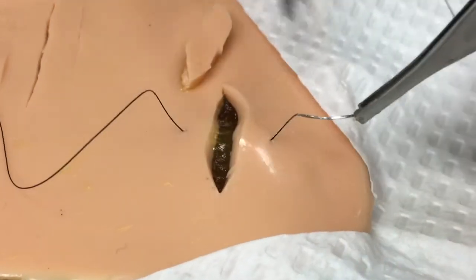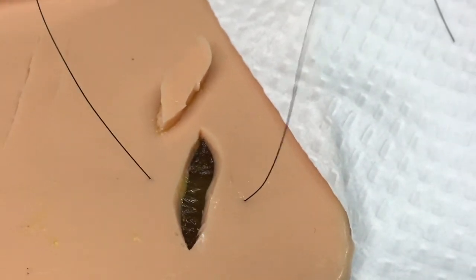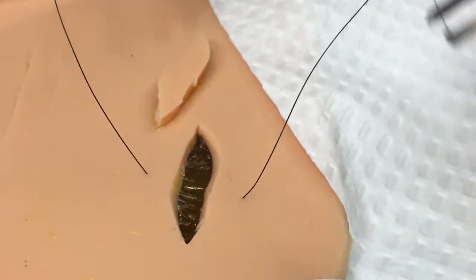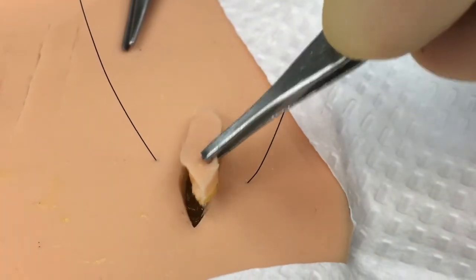You would first begin by placing larger bites in a similar fashion from one side of the wound to the other, traversing the wound. You would then take that evulsed piece of tissue and place it directly into the wound bed after carefully cleaning and debriding any foreign material.